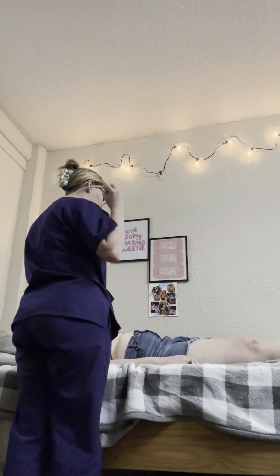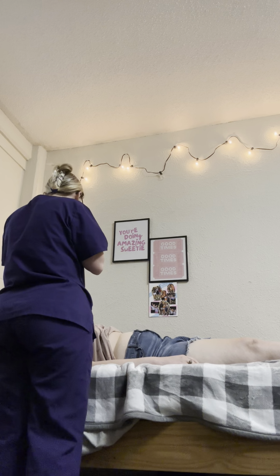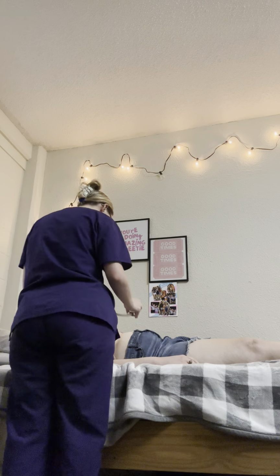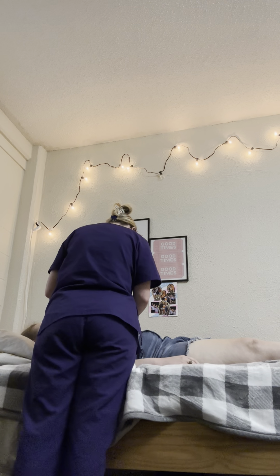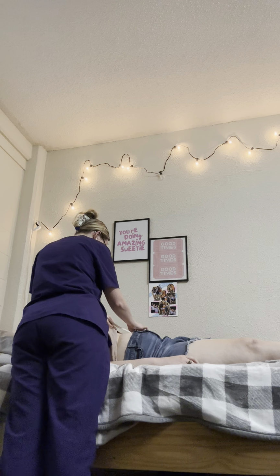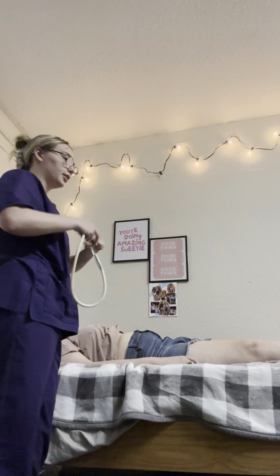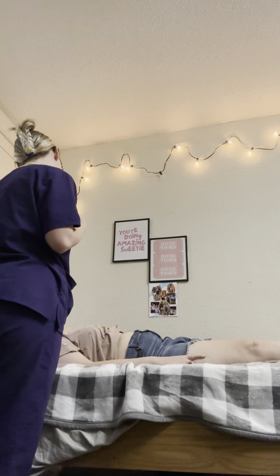Actually, I'm going to auscultate first. My stethoscope might be a little cold, I do apologize. Alright. There are no hypoactive or hyperactive bowel sounds. I did hear a little bit of growling. Are you hungry? Yes. Okay.